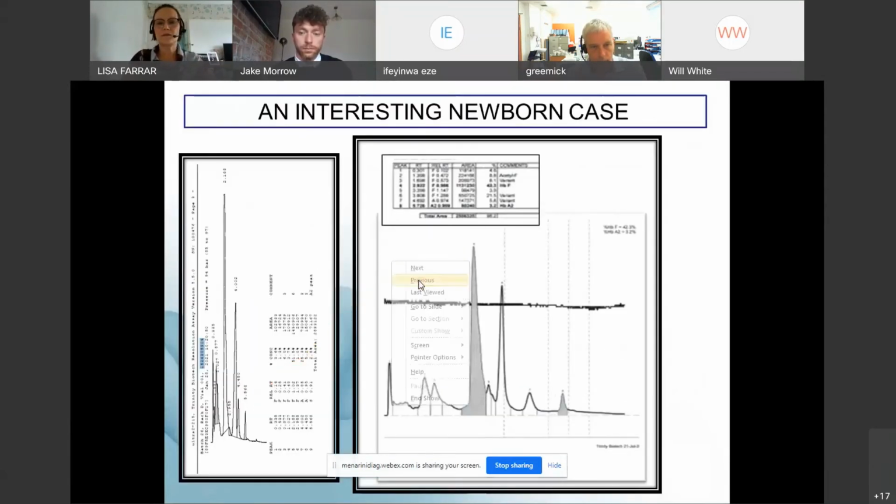So what we're going to look at now is a comparison between the peak that we're seeing here at 0.91 to S, that I would think was a D, and the one that we see on the 9210, which is 0.99 to A2, which clearly identifies it as a hemoglobin E if it was there. So you can see there's a difference between the two analyzers here. But the 9210 now helps us make a differential diagnosis. We know that that peak isn't D because it's running in the E position. We now have to determine what this abnormal peak is that's between F and A.